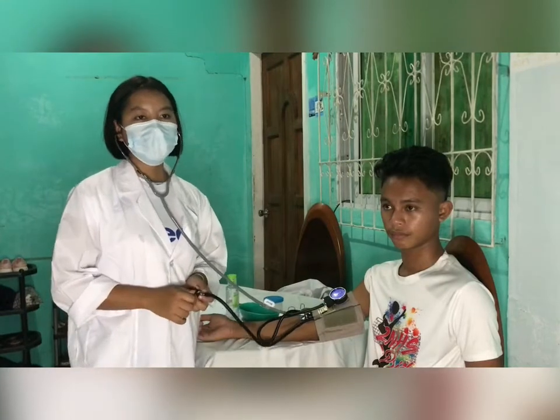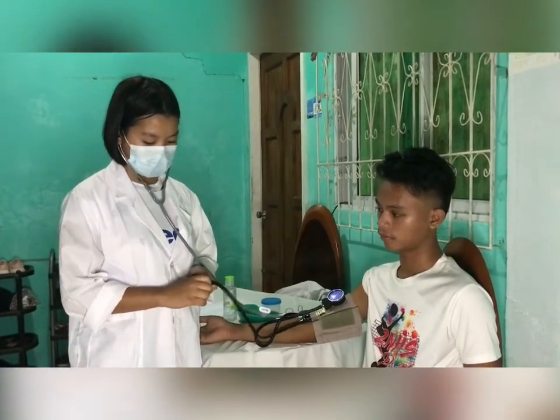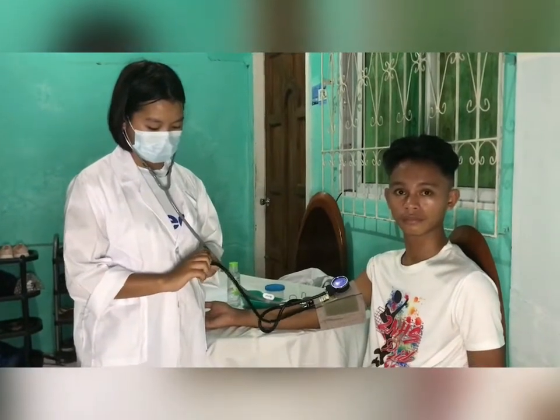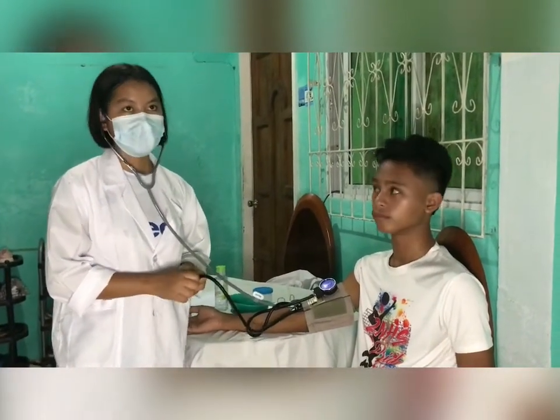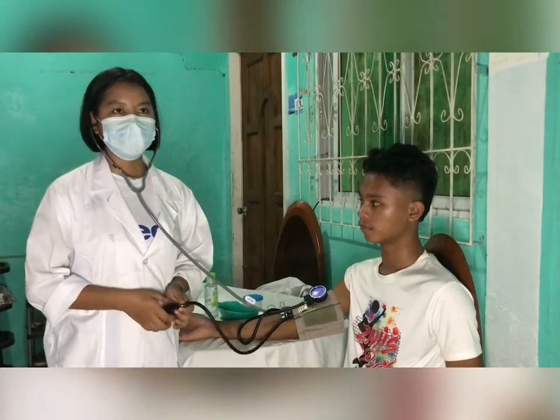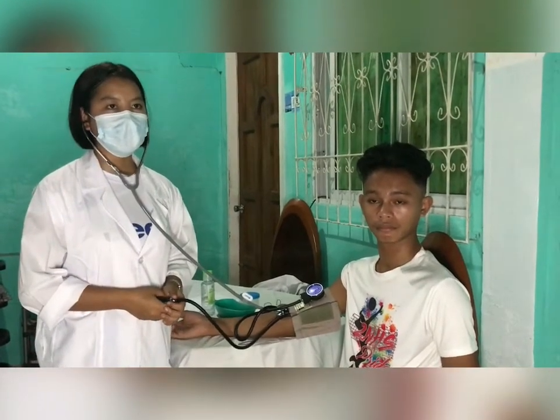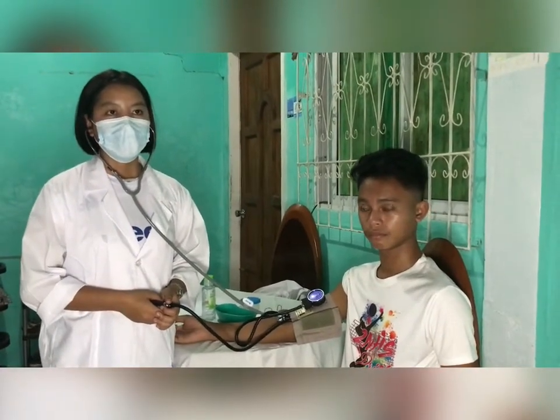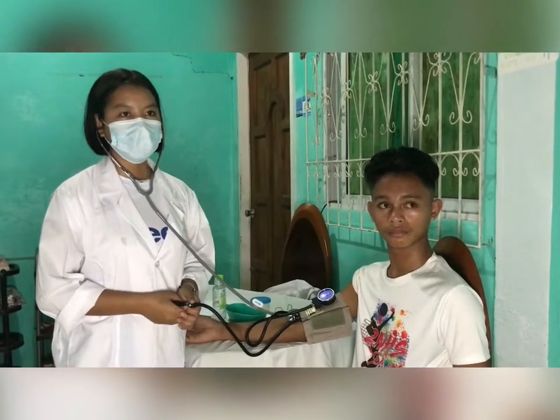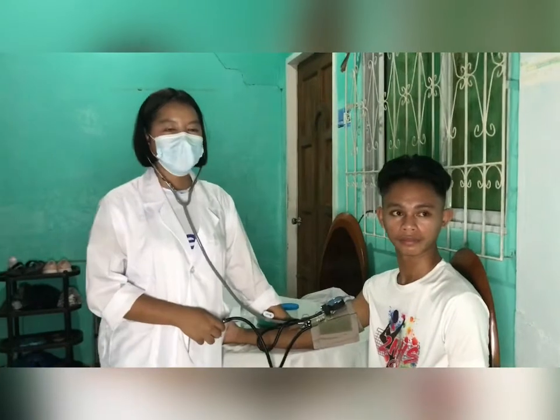Close the pressure valve clockwise until it is tight. Quickly inflate the cuff until the last sound. Slowly open the pressure valve and allow the manometer gauge to fall at a rate of 2 to 3 mmHg per second. Note the point on the manometer where the first clear sound is heard.